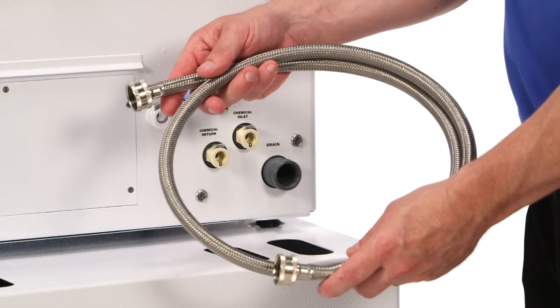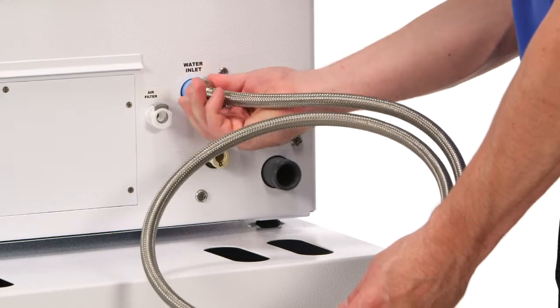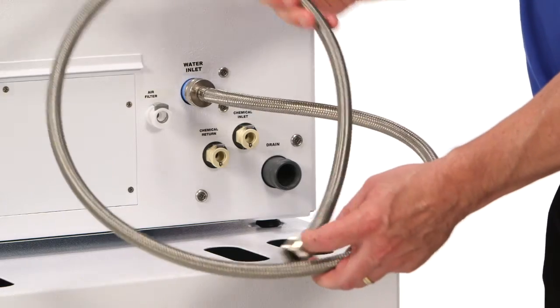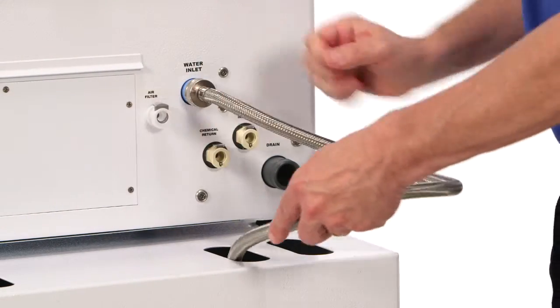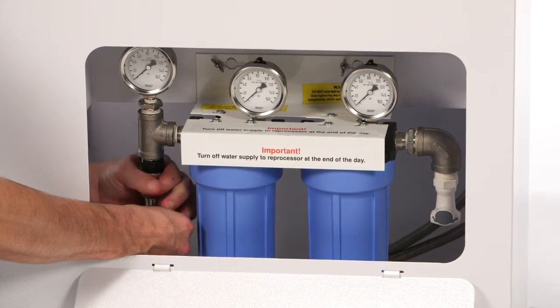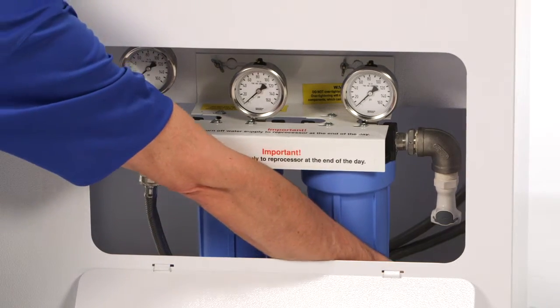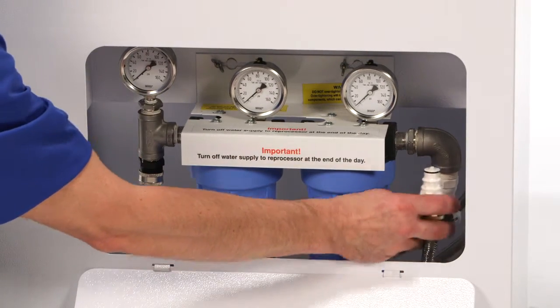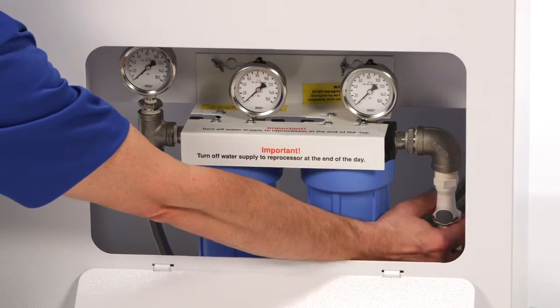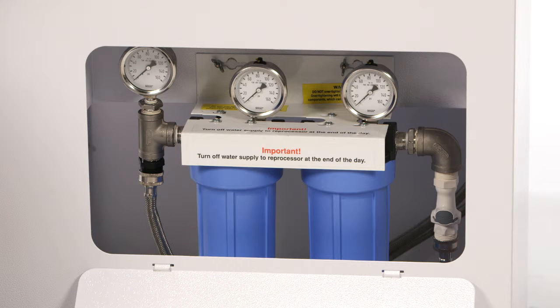To connect up the water filtration system, the stainless steel hose is connected to the CER Optima water inlet and then fed through the countertop or cart opening and attached to the 3-quarter inch hose connection of the water filtration system. Next, the incoming water supply line is attached to the water filtration system via the white-colored quick-connect fittings. Before turning on the incoming water supply valve, ensure the water filters are in place and the filter housings are securely tightened. Turn on the water supply and inspect for any water leakage.